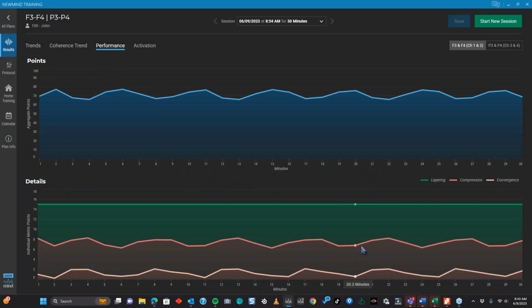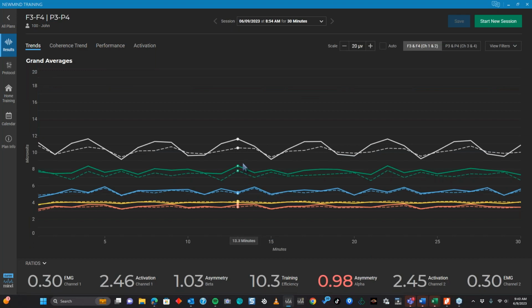Compression is just looking at the spacing between all of our component bands. So back to that example of somebody we're training with memory, attention, focus problems, TBIs for that matter, or somebody with sleep issues where their lack of quality sleep has caused an excessive amount of delta especially when they open their eyes.